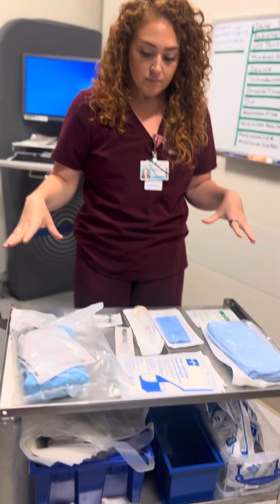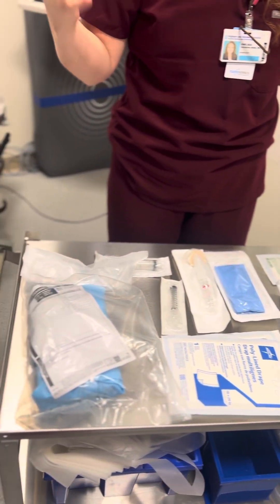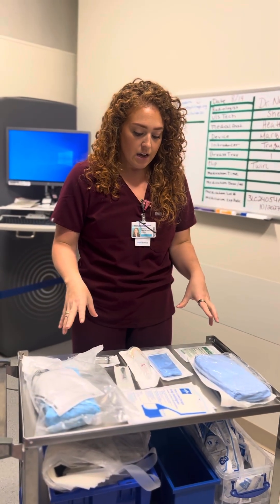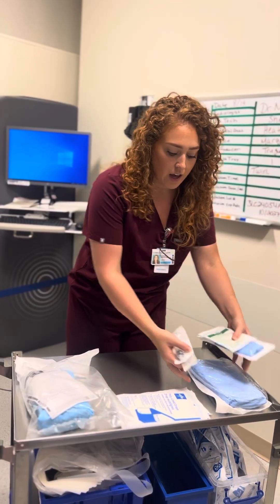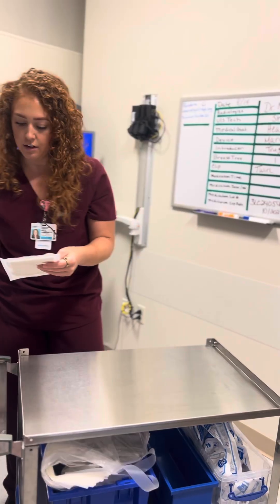We have all of our supplies here. You're going to have a list of pictures and a list of items that you're going to need — that's going to be found separately — but just so you can see all the items together, I'm going to start setting up the sterile tray.